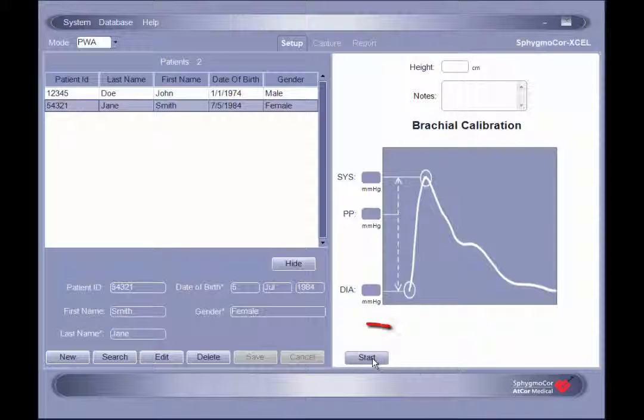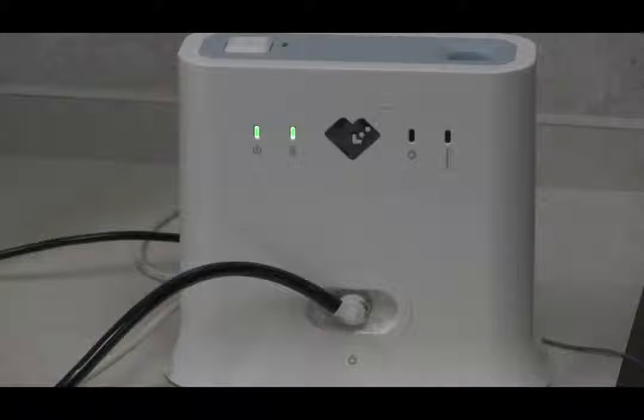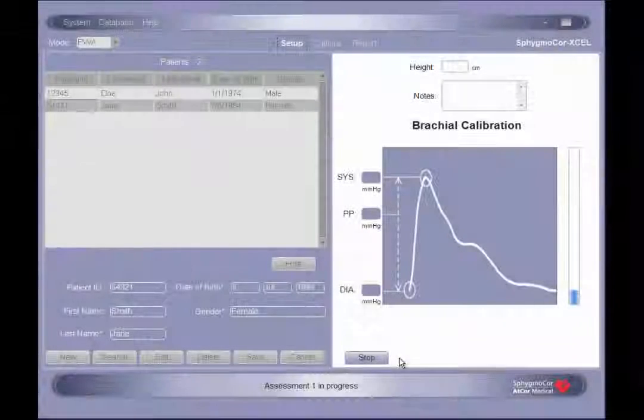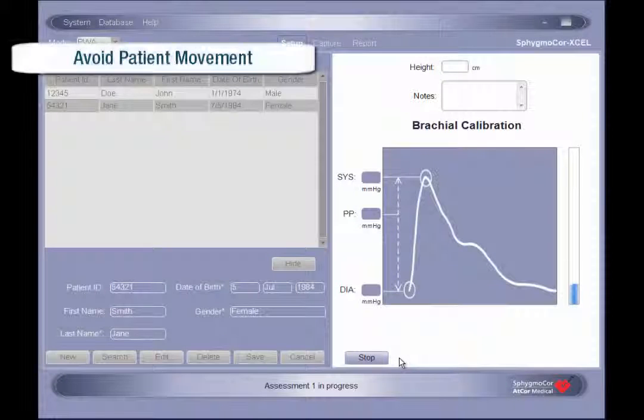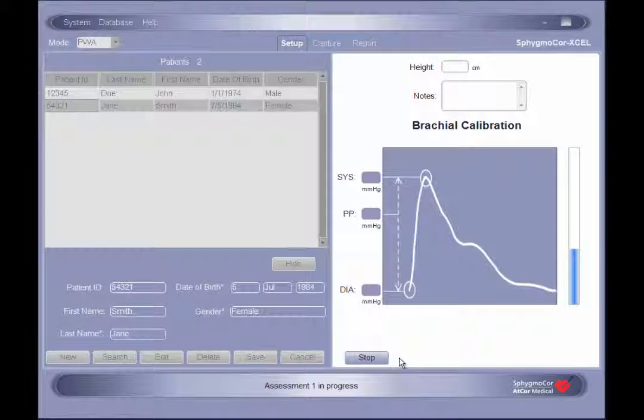To initiate the assessment, click the Start button on screen. There will be an audible click as the pump turns on and begins to inflate the cuff. It is important to ensure that the patient does not move, and both the patient and operator refrain from talking while the assessment is being performed.